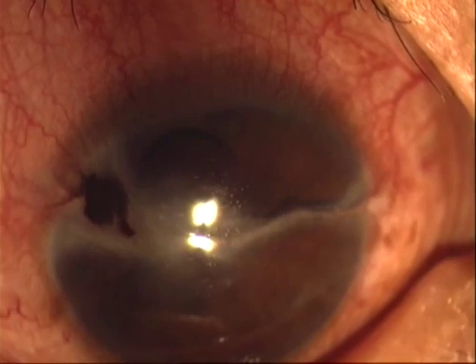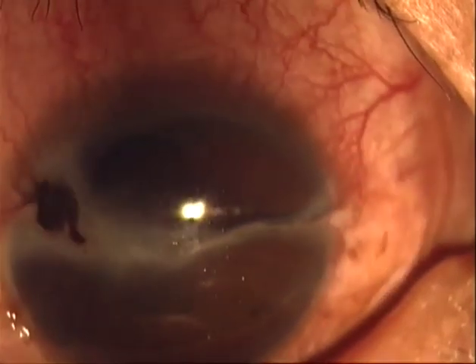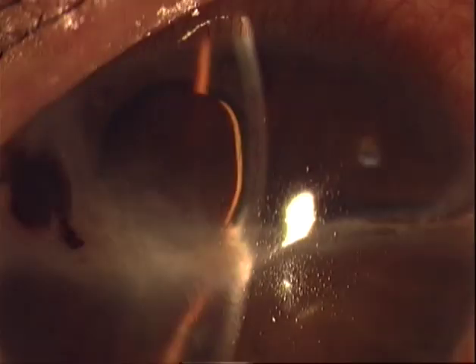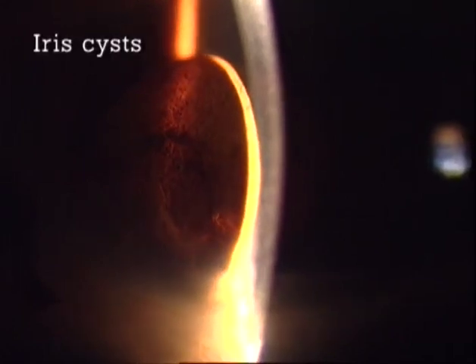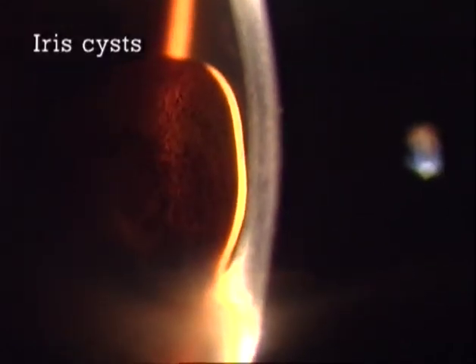Similarly, the examination of absorption can be used for analyzing the degree of pigmentation. These spherical tumors of the iris appear solid when their surface is observed in direct light. In retroillumination, however, a strip of backlight visible behind the brown sphere indicates it is partially transparent, and therefore it is not a tumor but a cyst.